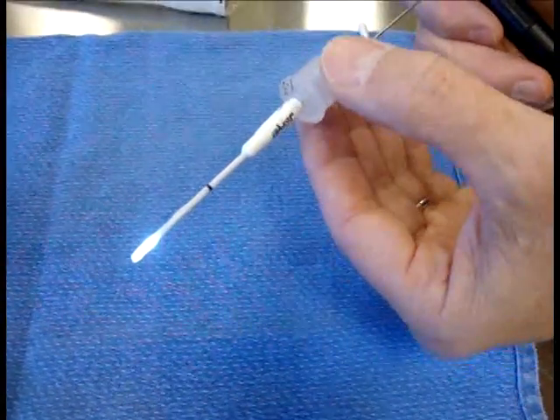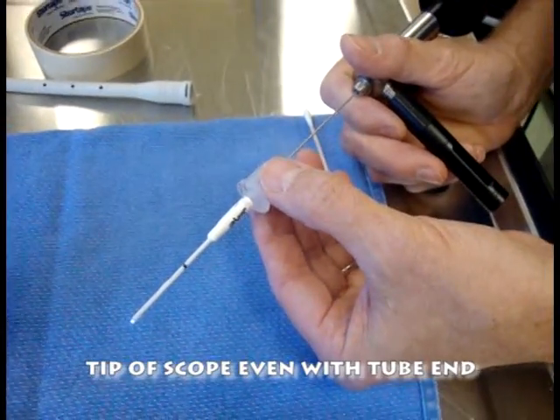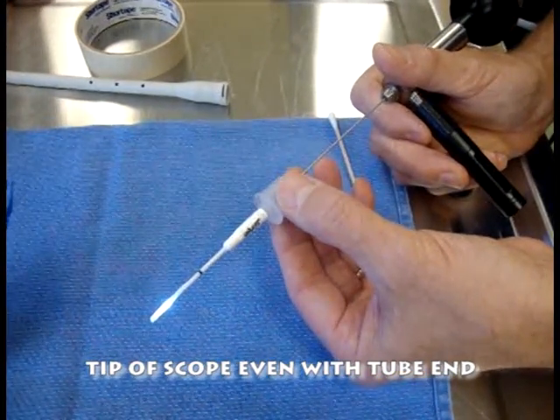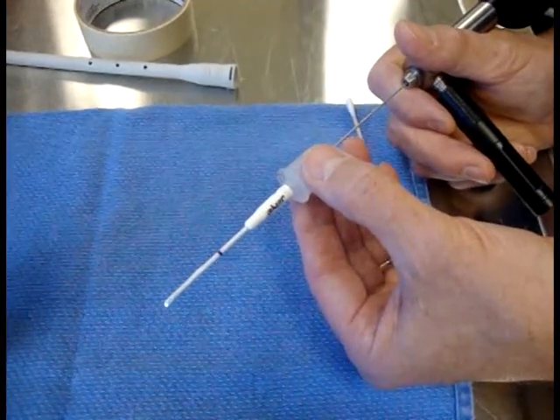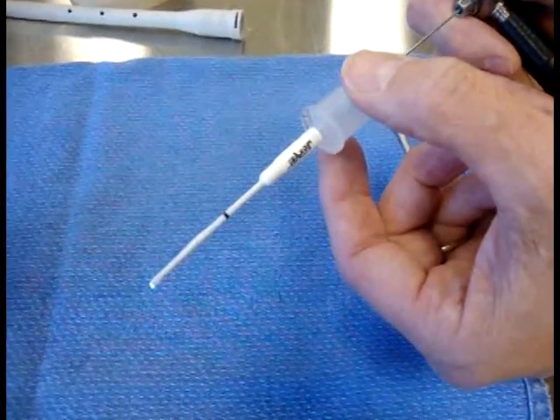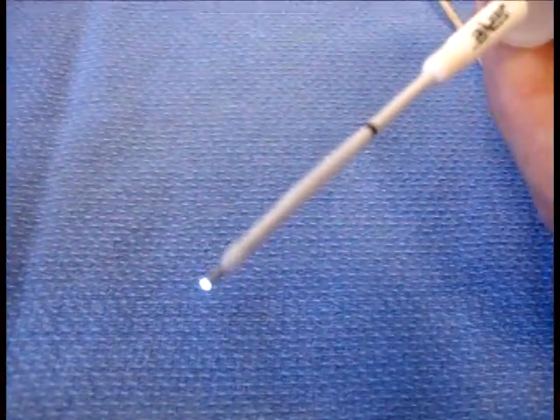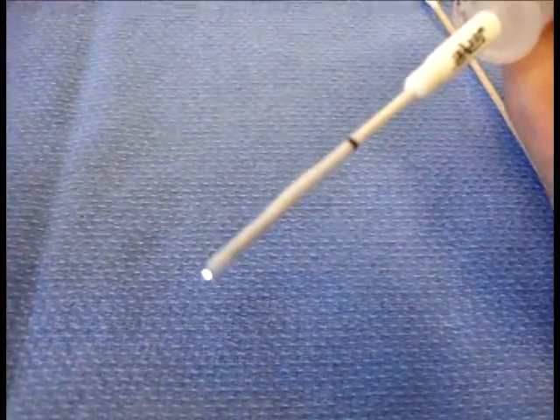It's very important that our endoscope tip be even with the end of the endotracheal tube — not too far inside, but right even with the tip — so that we don't capture and rake up mucus into the tip of the tube and cover the screen of our endoscope. Right there, it's perfect.